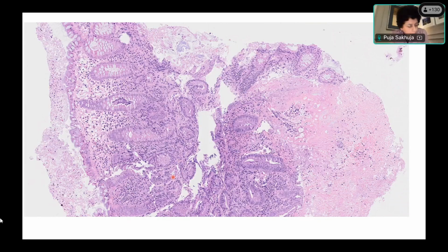So now who will tell me about this? Is Krupa here? Nilofer? Garima? Yes, ma'am. Yeah, you want to describe this?